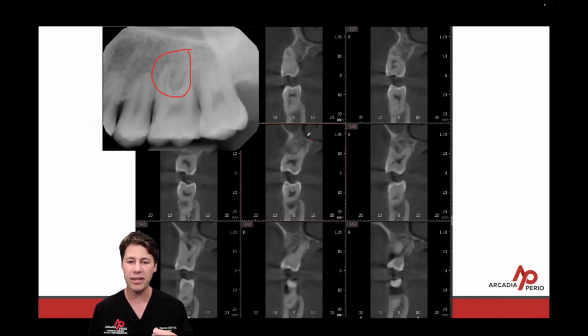But look at the start of the regeneration into the furcation. It appears to be bone. It looks like bone. It's resistant to probing now. That probe depth was about a 12 on the buccal, and now it's a 5, right? So things are going to continue to improve. So now I'm going to follow this case.